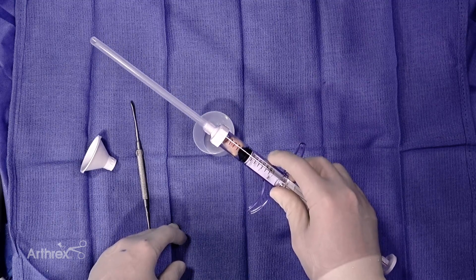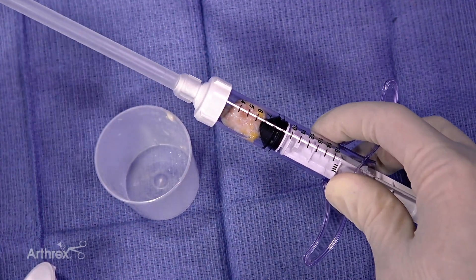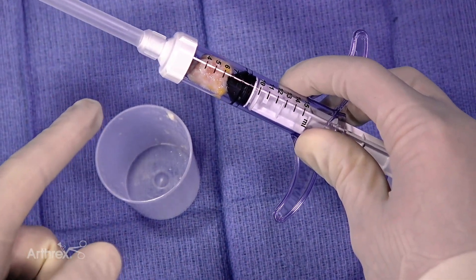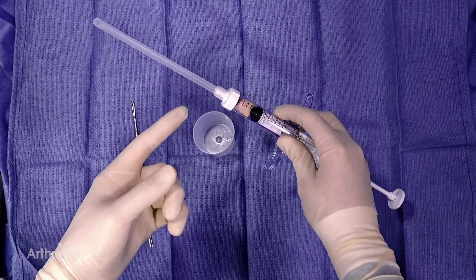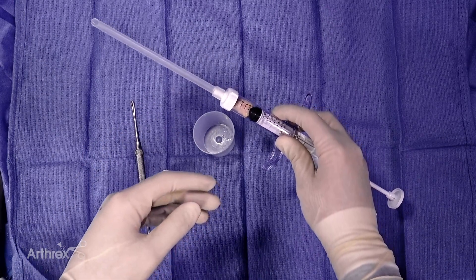One of the reasons I like using minced subacromial bursa tissue is that, as opposed to leaving bursa intact or using an entire sheet of bursal tissue, mechanical chopping or processing of the bursal tissue helps with cell migration. Presumably, that will help these cells contribute to the healing process after rotator cuff repair more effectively.